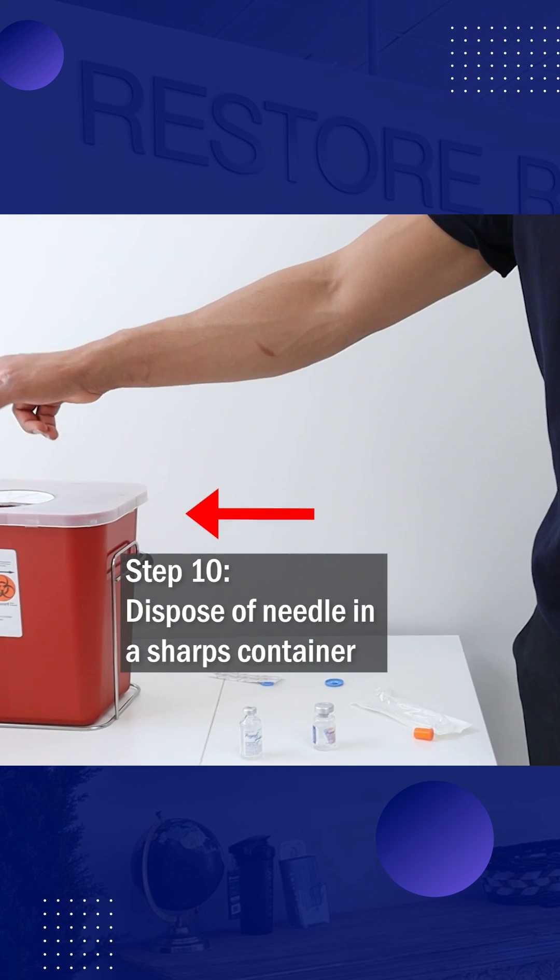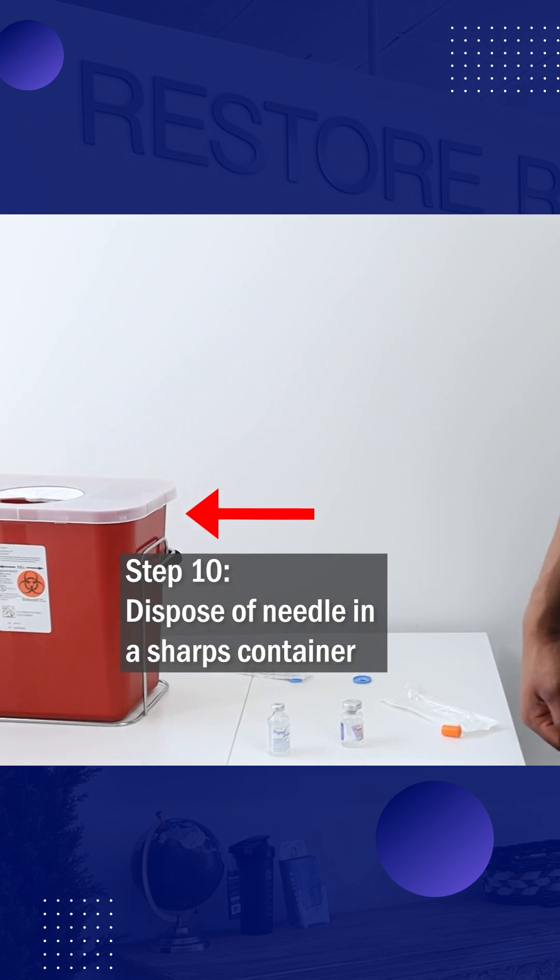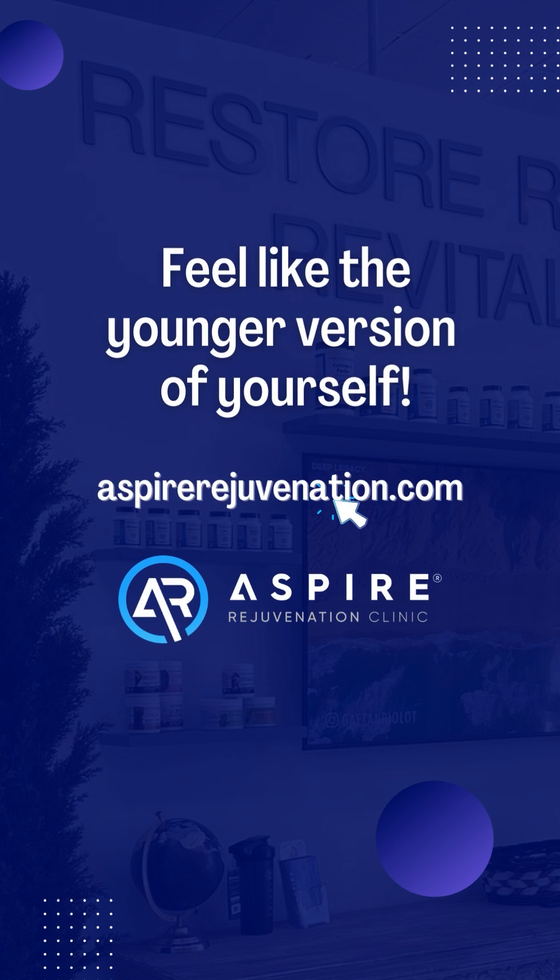Lastly, recap the needle and dispose of it in a sharps container.